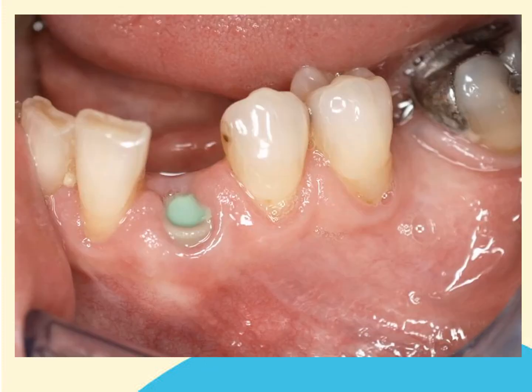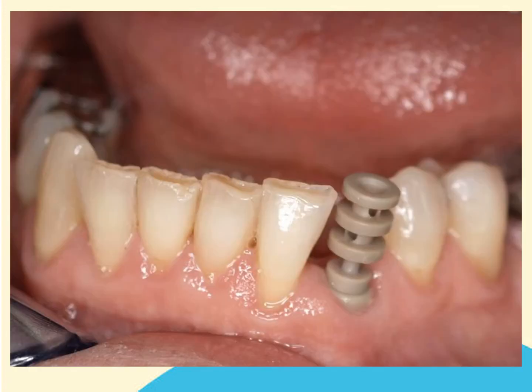This clinical picture shows a base in situ on top of an implant in a patient's mouth. For hygiene reasons it has been covered with putty. The putty has been removed and the clicking top pushed into the base so it fits securely. You will not necessarily hear an audible click when the two components go together, but the component should be quite firmly attached with minimal or no mobility.